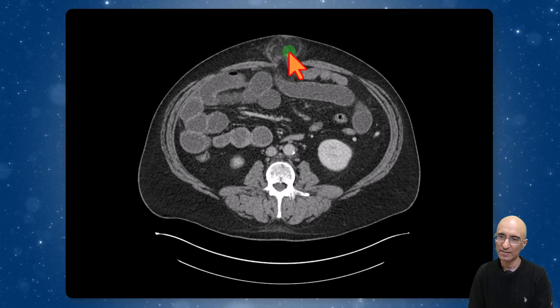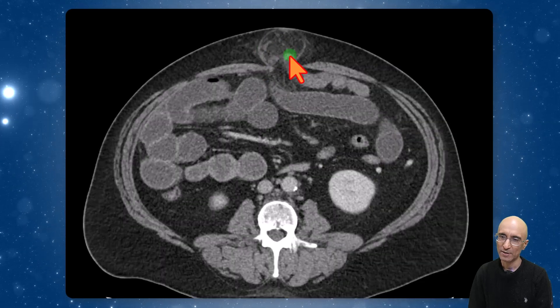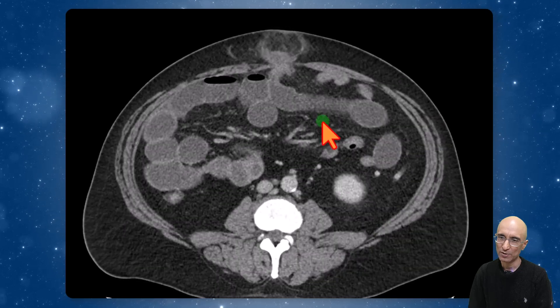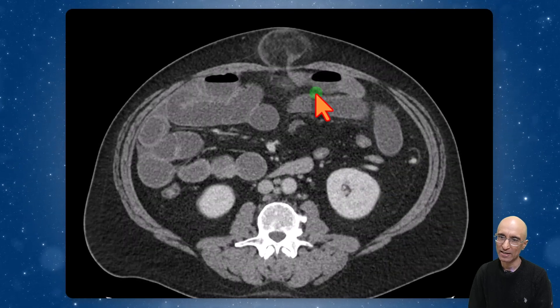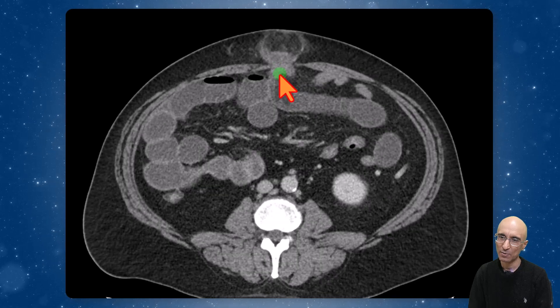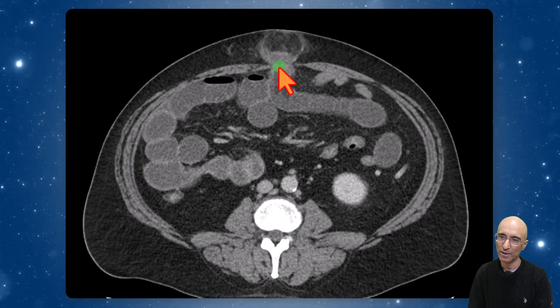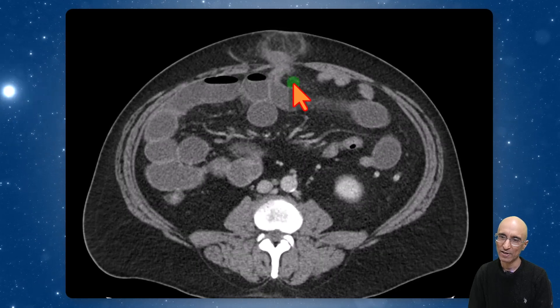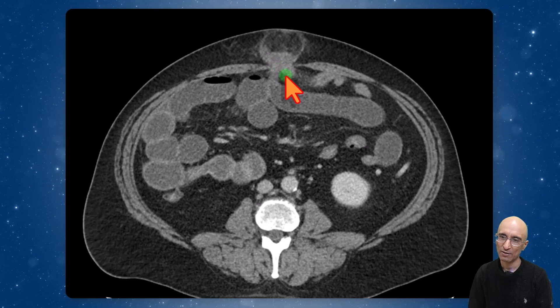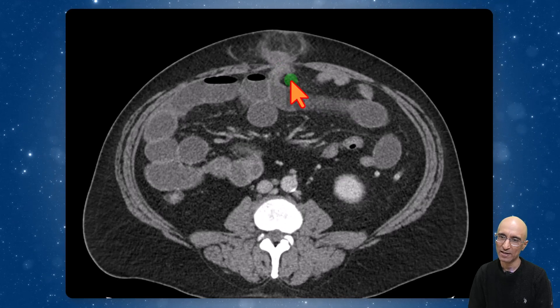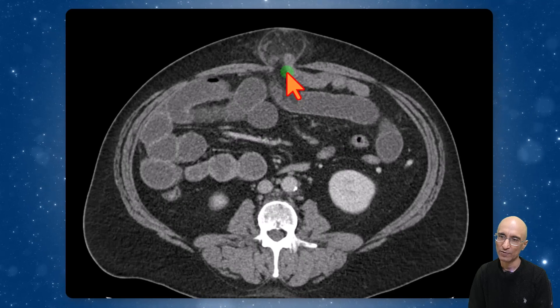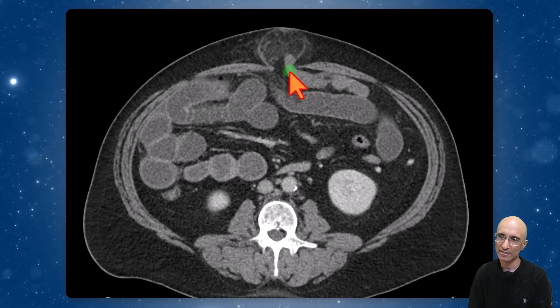Within the hernial sac we can see a little bit of edema and fluid. As I scroll back and forth at the level of the umbilical hernia, we can clearly identify a fluid-filled dilated small bowel loop abruptly tapering at the level of the hernia. The afferent loop is pinched at the level of the umbilical hernia, and the efferent loop coming out of the hernia sac is decompressed.